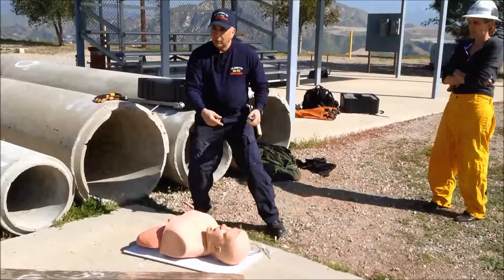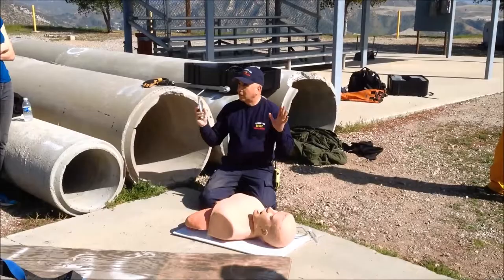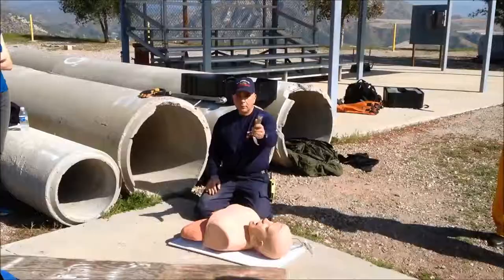If you meet the patient that way, you're going to have to intubate face-to-face, right? So from the front.